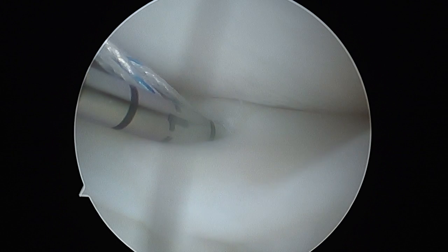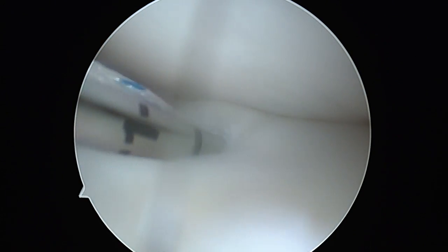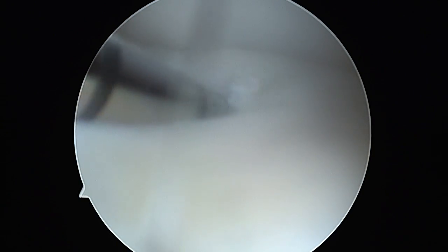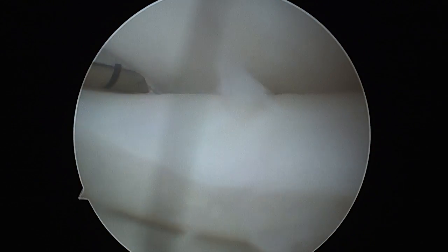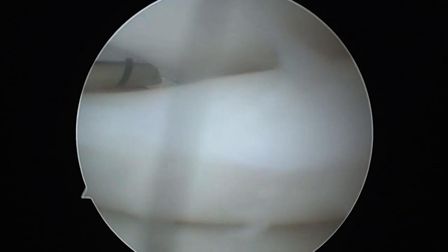Be careful and make sure that the tip of the needle does not go out of sight. One has to be very gentle when pulling it out of the meniscus. Keeping the tip in sight, plan where you are going to place the next anchor.